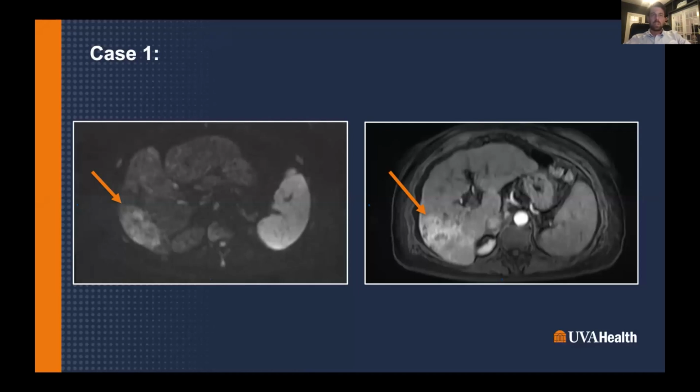What I thought I could do would be to show several challenging cases that we've encountered, highlighting some of the difficulties that you've discussed in your talk and demonstrating what we believe is a need for a more nuanced approach to the LI-RADS treatment response algorithm in dealing with difficult cases like these.